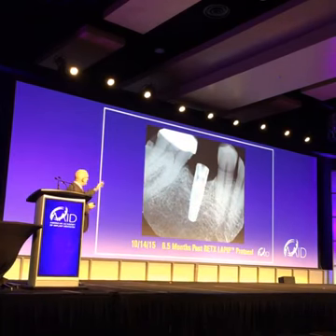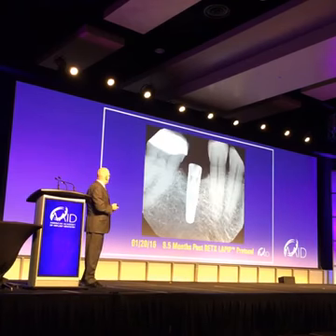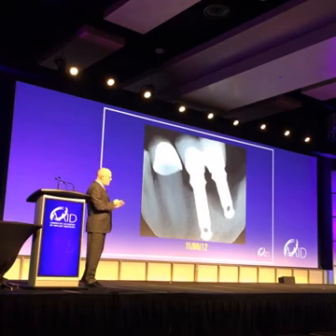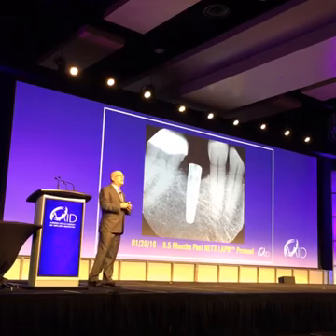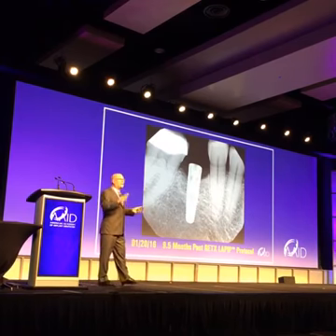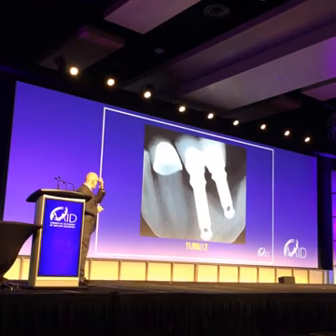6.5 months later, it's starting to look better. We're starting to get reossification. It looks like it's filling in more. 9.5 months later, it's looking good. And now he went ahead and got it restored and everything's looking great. But again, you can retreat it. That's the nice thing, I'm not cutting away tissue. I'm not smoothing out threads. It's looking good.